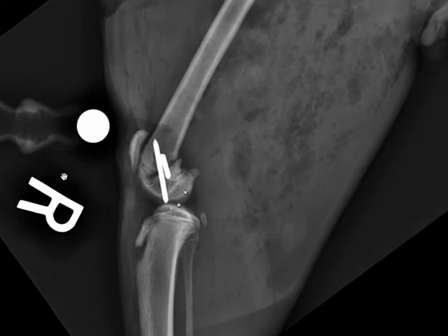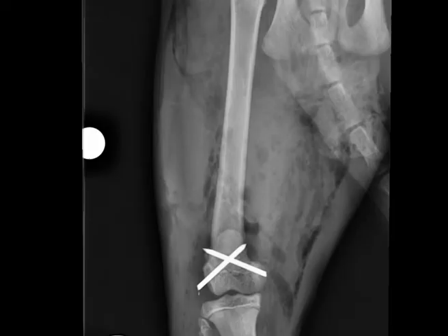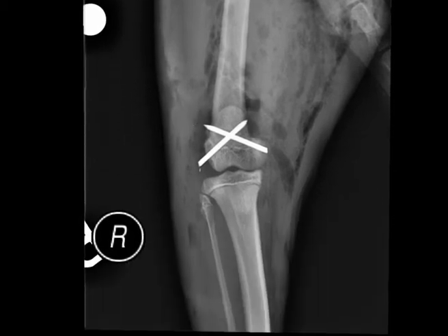The last thing in our ABCDs is devices. We don't always get to look at devices, but in this case we have the opportunity. Now, one of the challenges about being a teleradiologist is we're often assessing a fracture that we weren't directly involved in repairing. I think that interacting with the clinicians that repaired the fracture is a really important thing, but I will make a few points.